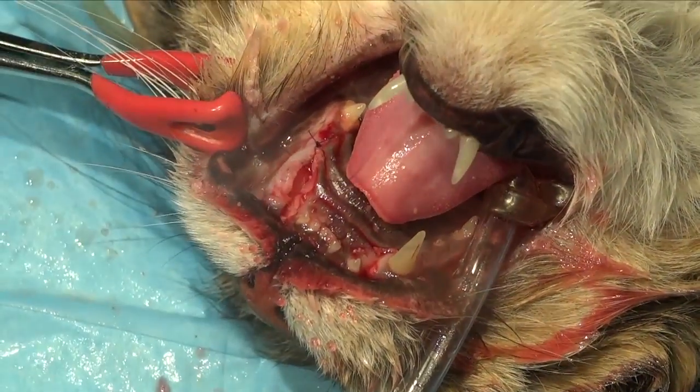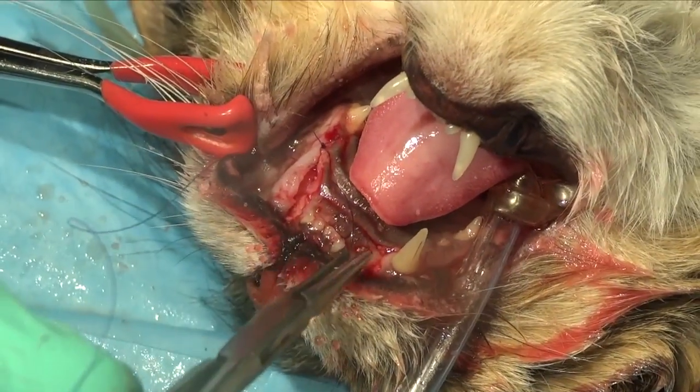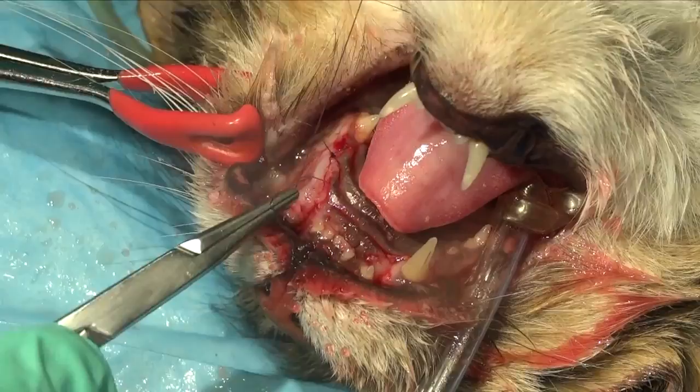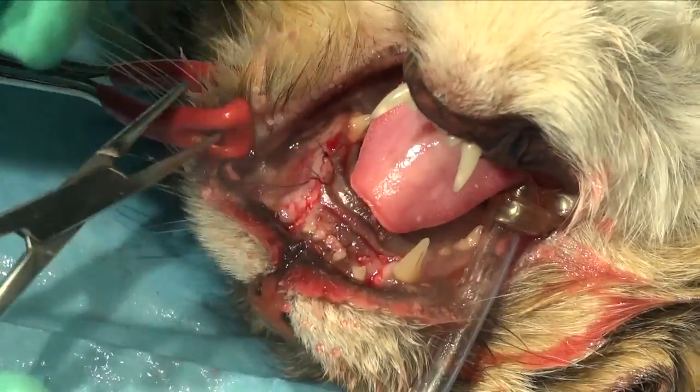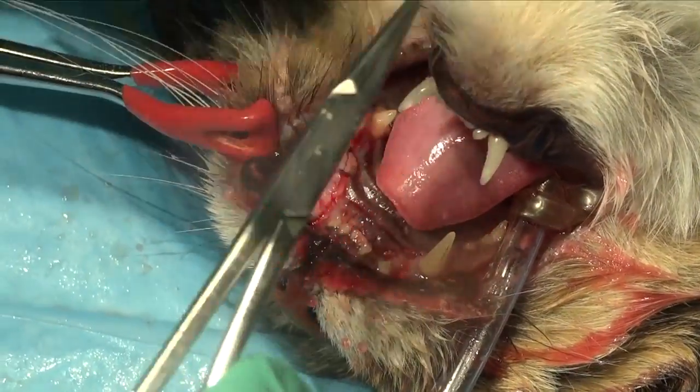We keep our patients very light throughout the entire procedure. We always do nerve blocks. We like to have a palpebral reflex and a swallowing reflex during the procedure, and very often we're able to achieve that.